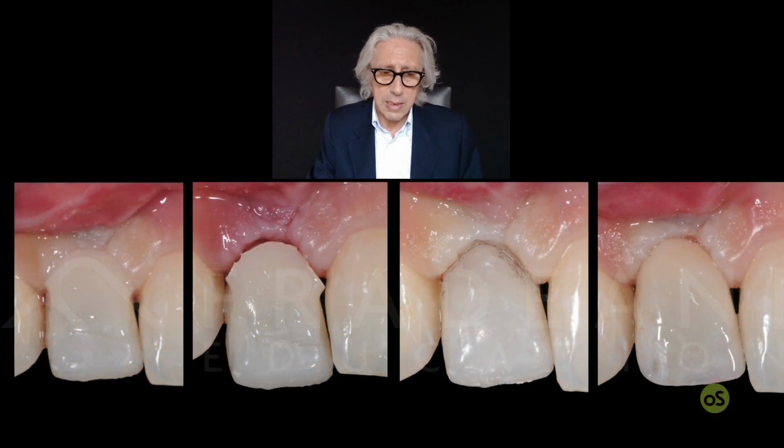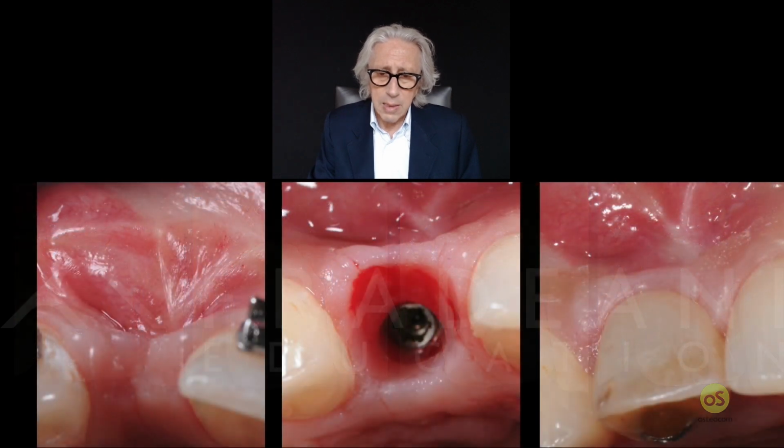And actually, I could start later on to really condition the soft tissue, recreating a new kind of pressure to achieve good papilla height. We have some pressing on this area, the buccal area, but we have the growth of the papilla height. And you can understand here the difference between the beginning and after the final outcome. We are still in provisionals, but you can notice that the provisionals are right now in a better position than before. And we have the chance to see that we now have a good final outcome.